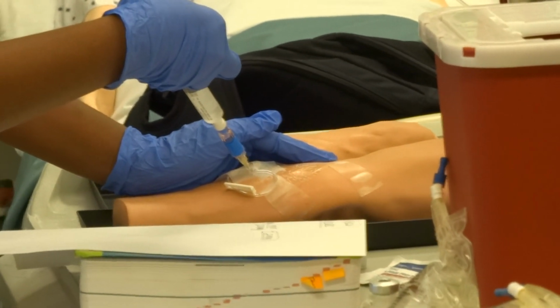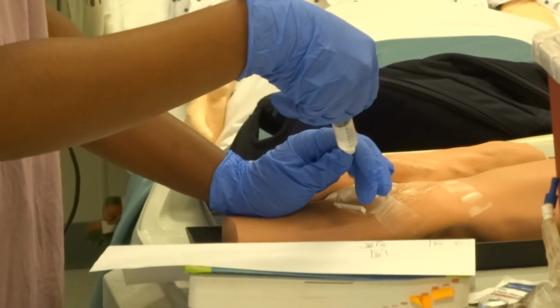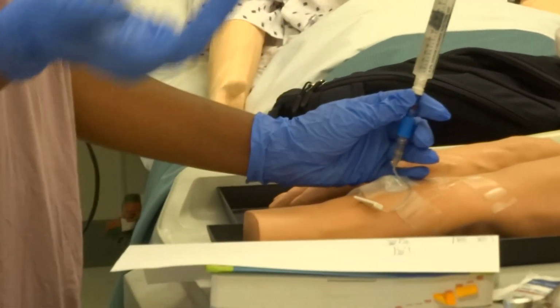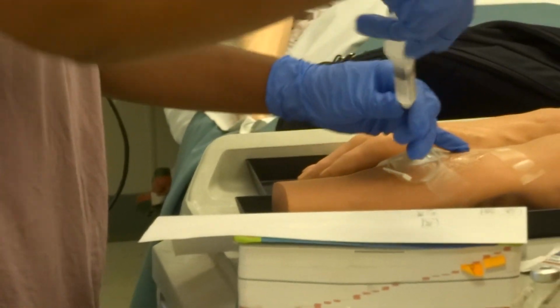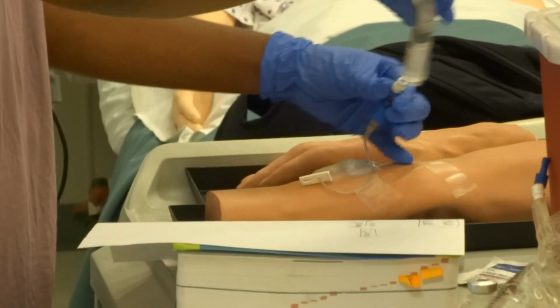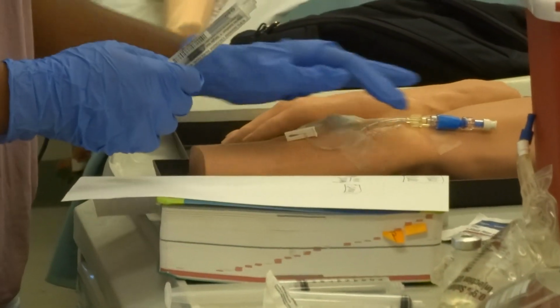And I'm gonna actually sit there for an additional 2 minutes, despite what the nurses say. There may be medication in this line, and since we're pushing that medication over 2 minutes, it's only right to push a normal saline, which is also considered medication, over 2 minutes as well. So, before I take this off, I'm gonna go ahead and lock this. I pushed the entire thing. If it's taped, just neatly push it, put it on the side, just like that.